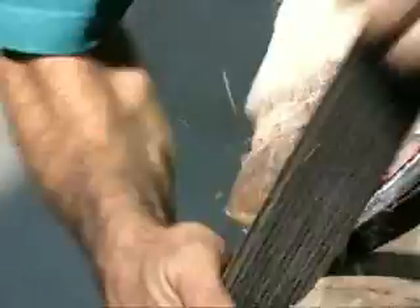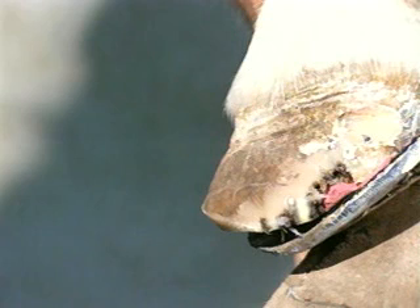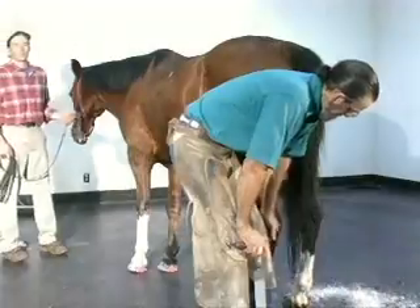It's very seldom that I will ever get a quicker horse in this particular area. As you finish the toe off, I'm not trying to make it look as if this mare did not have laminitis. I simply want to remove a little excess toe so she does not use that as a lever. Notice the gap between the shoe and the foot — this allows me to treat the penetration from the front using the shoe as a hospital plate. To take this wall off completely from the front actually weakens the hoof capsule. It's a lot of work for nothing, and it's very detrimental.